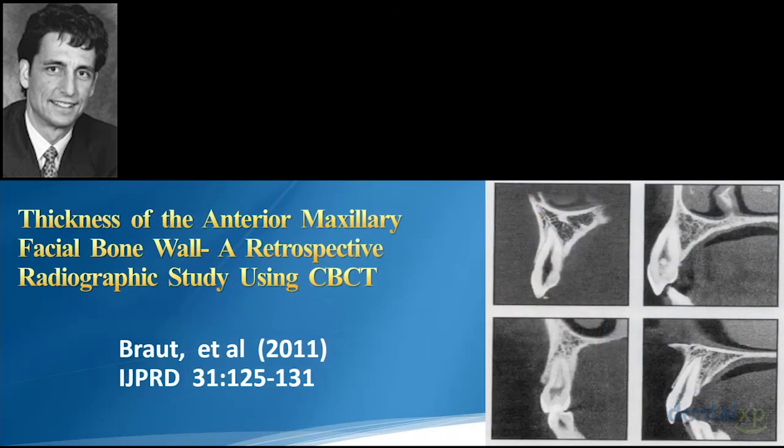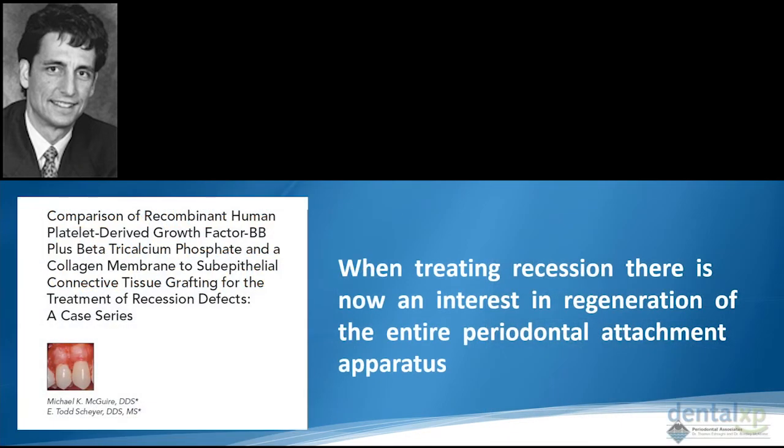Many of the orthodontists are not utilizing this three-dimensional technology. We're trying to get them on board, but many of them don't, and that can severely impact your outcomes. This is an article, I believe, out of Boozer's group, but showed that about 85% show less than 1 millimeter in the anterior maxilla, looking at CT scans. So what that means is there's a lot of teeth out there that are going to have zero to no buccal plate.